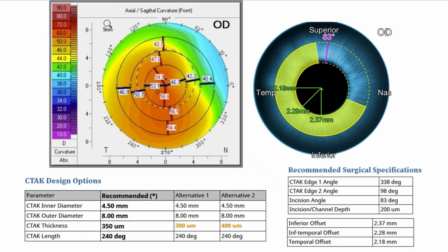And we'll get into case selection in a minute, but I also like this conformation for your first cases. This snowman conformation. This is your most typical conformation for keratoconus. These are nice. I think that these are the most predictable by the nomogram in terms of the reshaping, right?